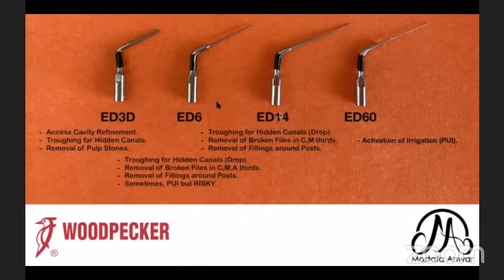The ED14 is the same as the ED6, but I can use it only in the coronal and middle thirds — I cannot use it in the apical third during broken file removal because this tip is thicker in size than the ED6. The ED60 looks like a K file, but its flutes are non-cutting. So it can be used for activation of irrigation, which we call passive ultrasonic irrigation.